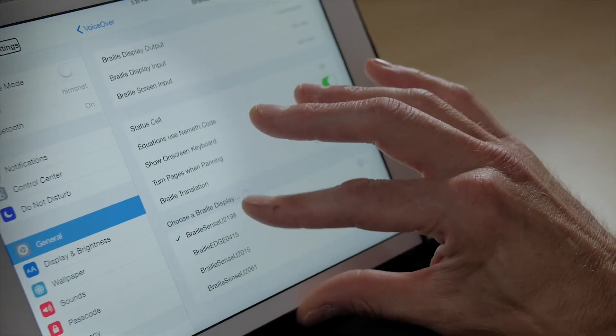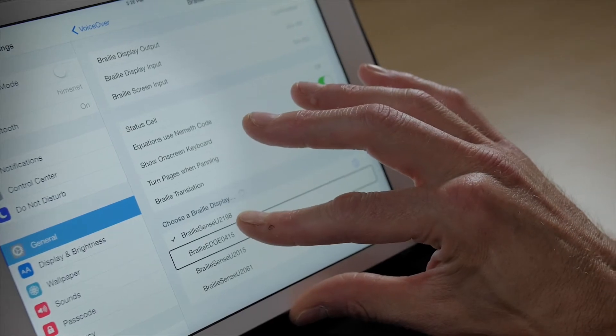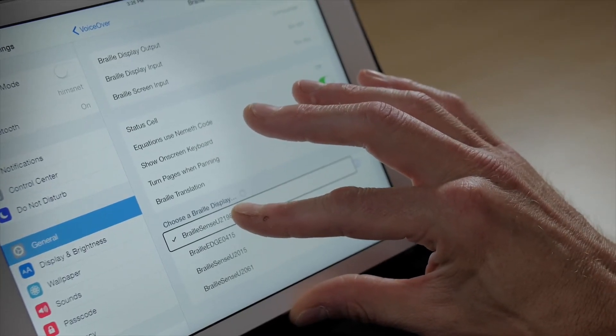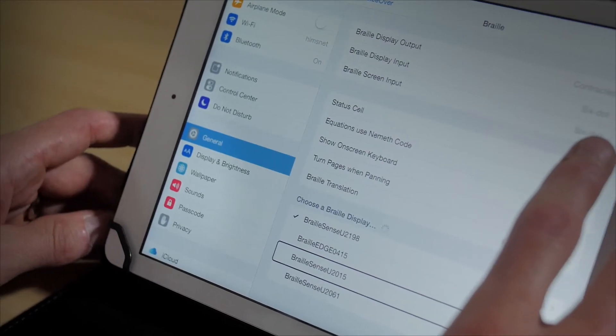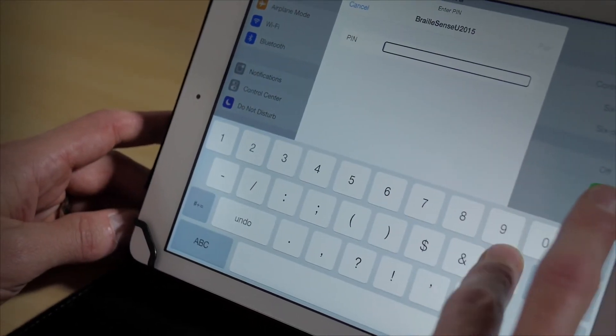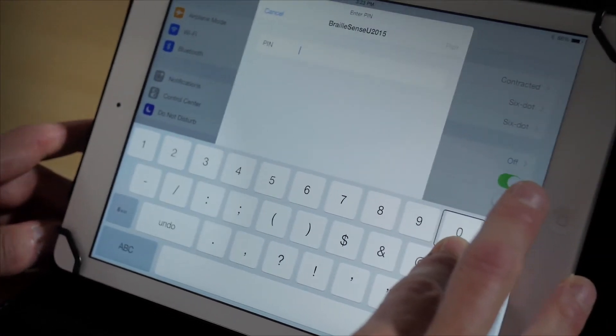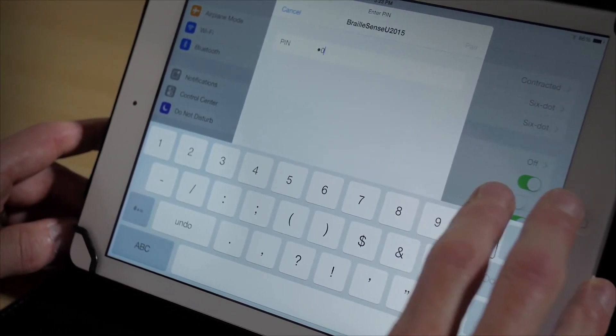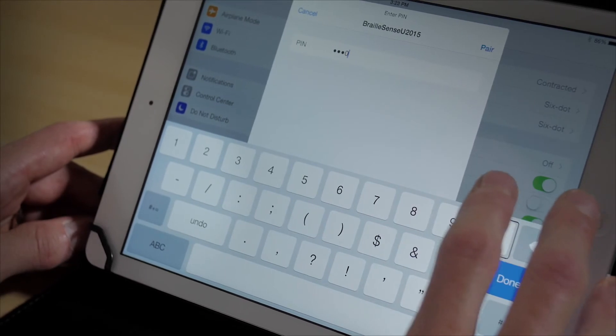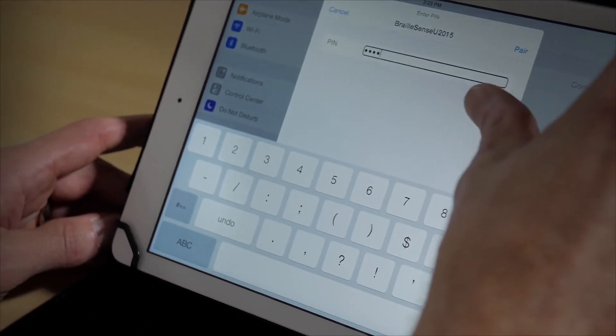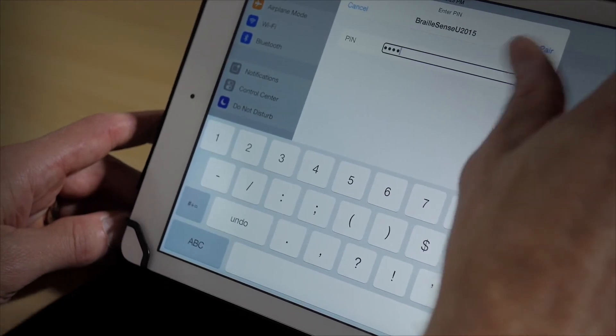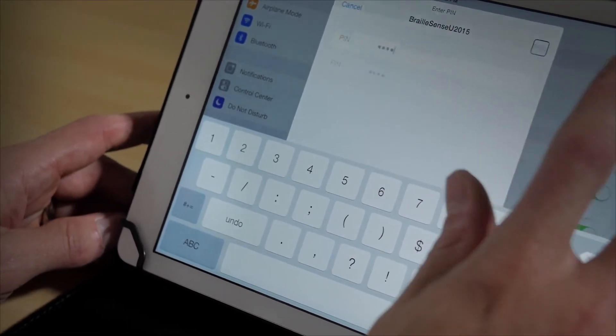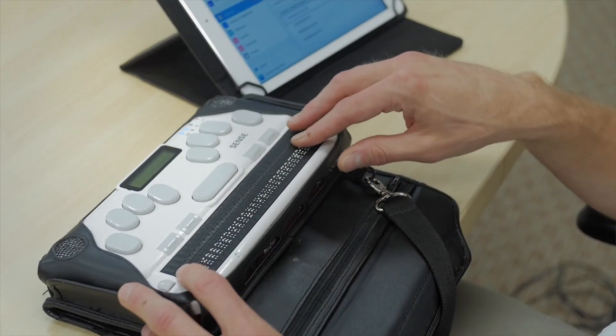Under Braille, we are going to choose the BrailleSense that we want to connect to. Now it's going to ask for a PIN code. Our PIN code is 0000. And we'll go to pair. And we have Braille.